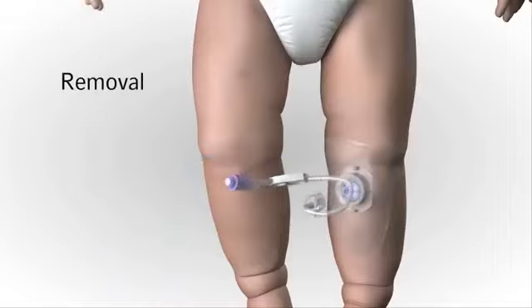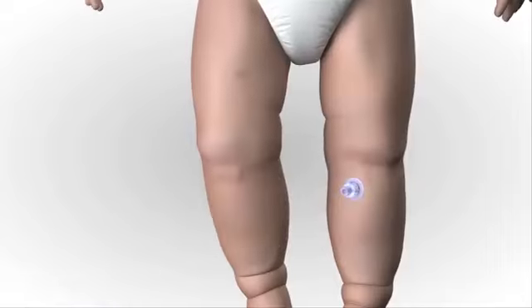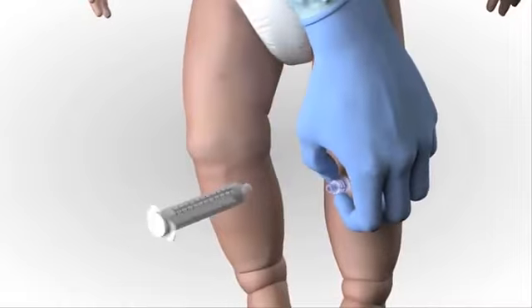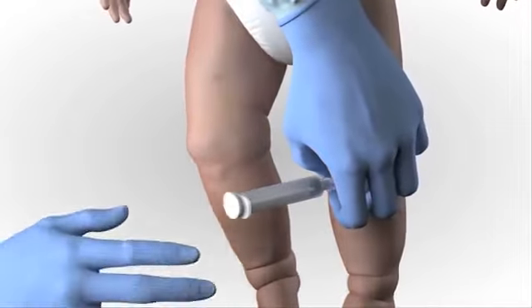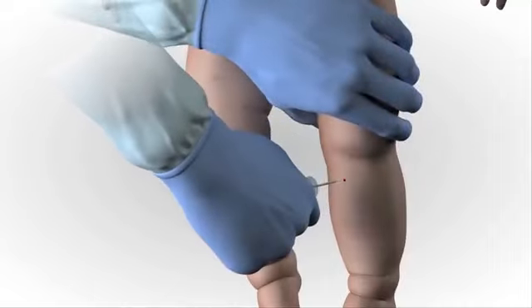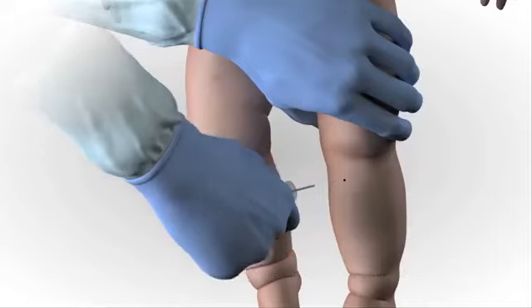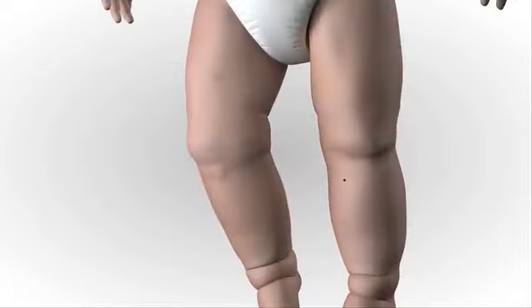Remove extension set and dressing. Stabilize catheter hub and attach a Luer-Lock syringe to the hub. Maintaining axial alignment, twist clockwise and pull straight out. Do not rock the syringe. Dispose of catheter with syringe attached in a sharps container.